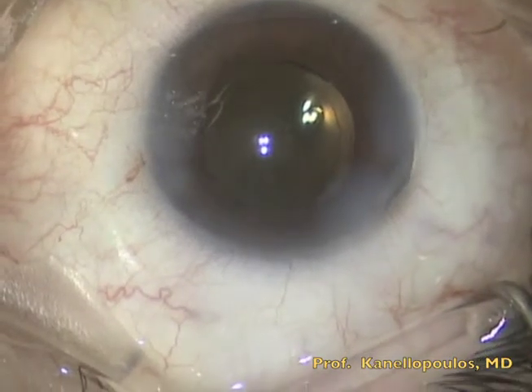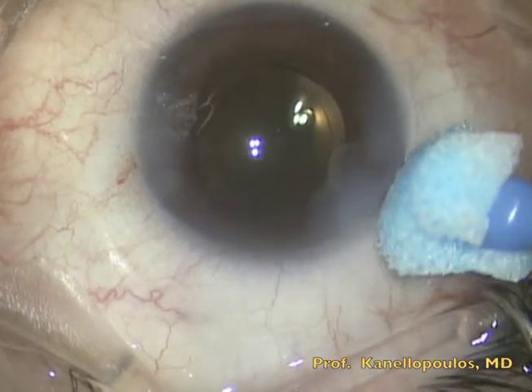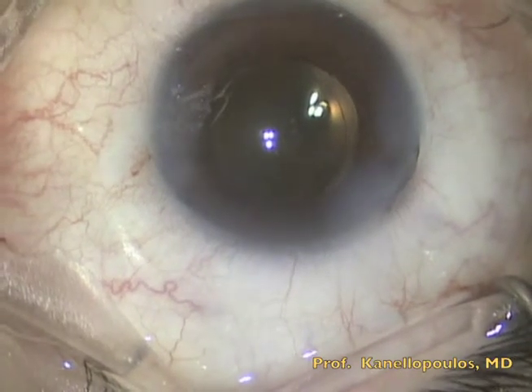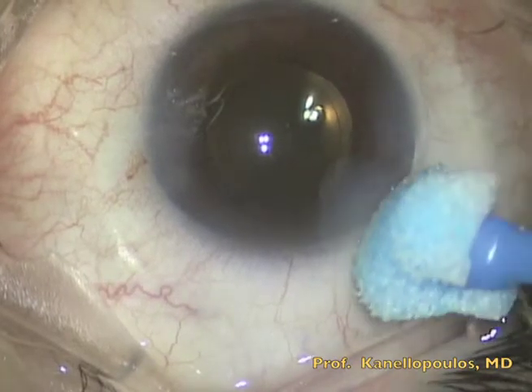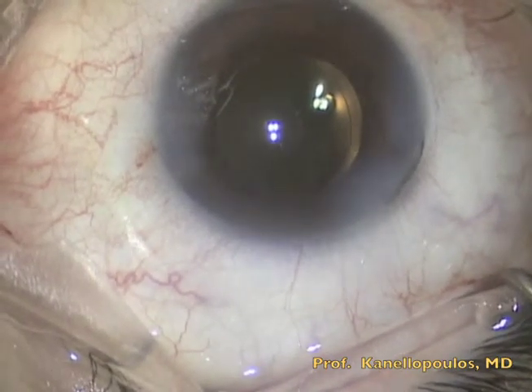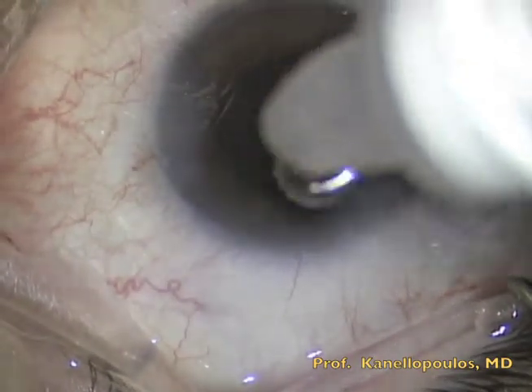The ocular bandage is placed right on the incision site to assure secure closure and avoid the placement of a suture. In routine cataract surgery, we did not use a suture, but this does not assure that the incision is watertight. It is possible for fluid to ingress, causing loss of the chamber and endophthalmitis.